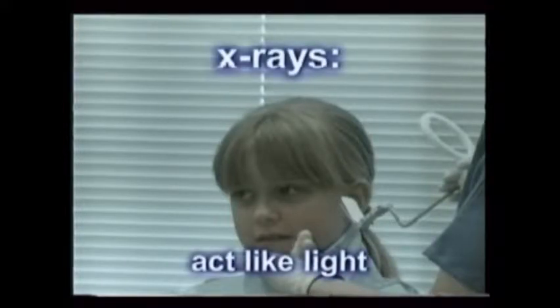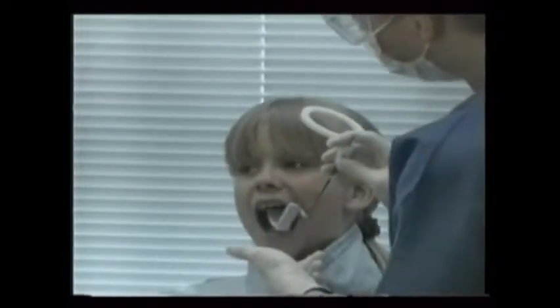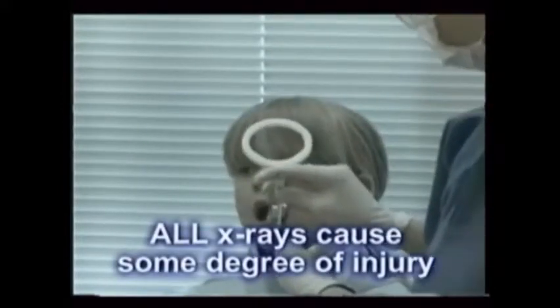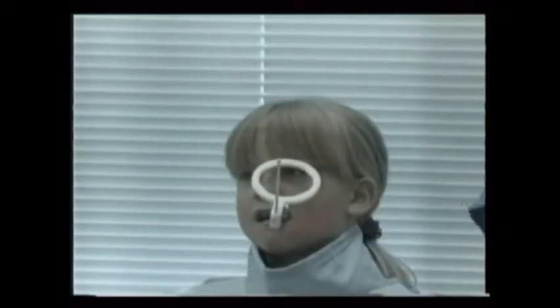In order to be able to properly use X-ray in treating patients, we must have some idea of what it is and how it works. The best way to create these ideas is to have you think of a flashlight beam. X-rays behave very much like light rays, but with some obvious variations, like being able to penetrate solid substances. They have many great properties that enable them to do their job of letting us see within. Again, the bad news is that every time we expose someone to X-ray, tissue undergoes some degree of injury, albeit minor and reversible. It's the trade-off to be able to prevent or help heal them from disease.